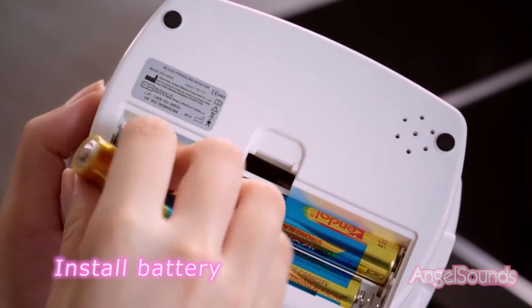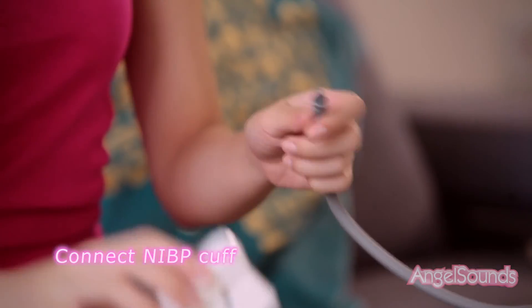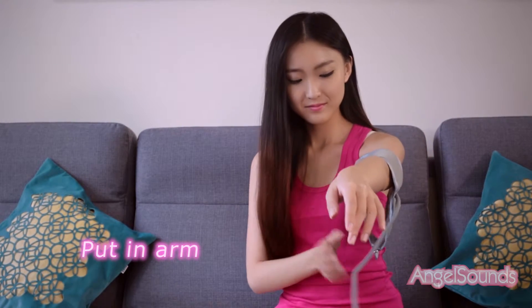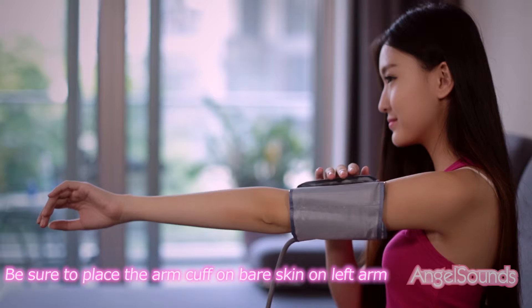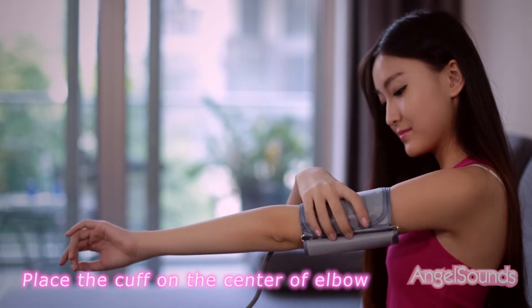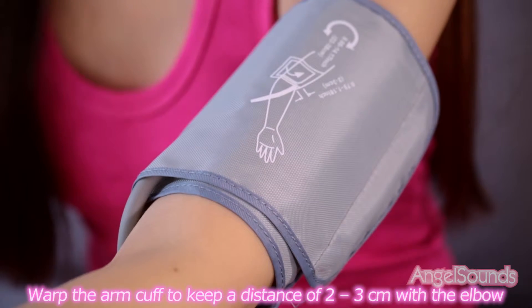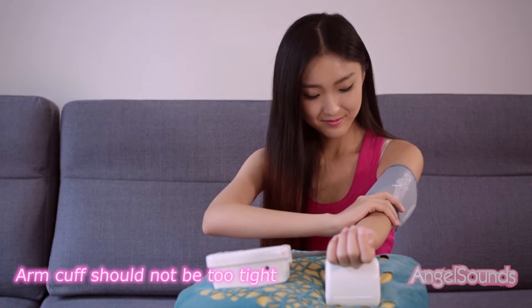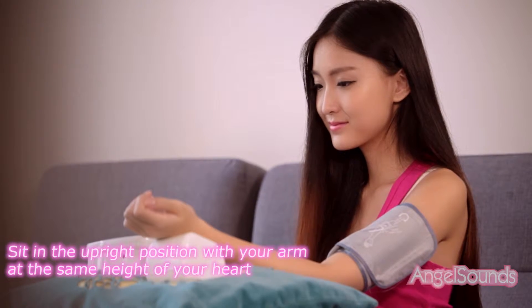Install the battery and connect the NIBP cuff. Put your arm in and ensure to place the arm cuff on bare skin on the left arm. Place the cuff at the center of the elbow, wrapping it to keep a distance of two to three centimeters from the elbow. The arm cuff should not be too tight. Sit in an upright position with your arm at the same height as your heart.